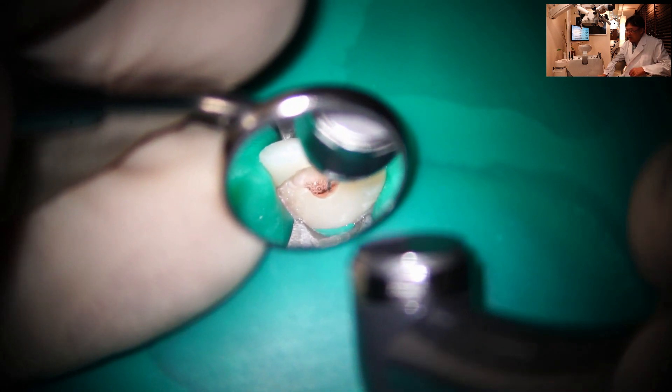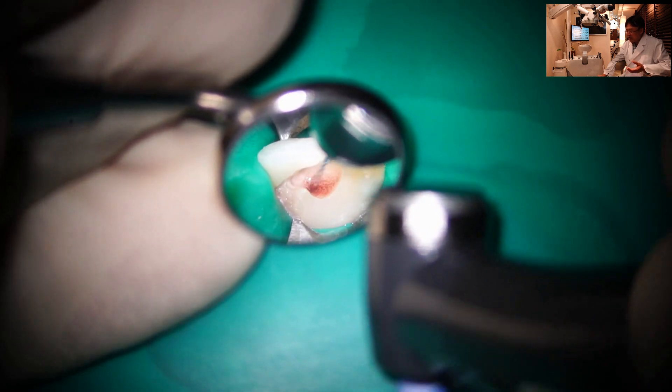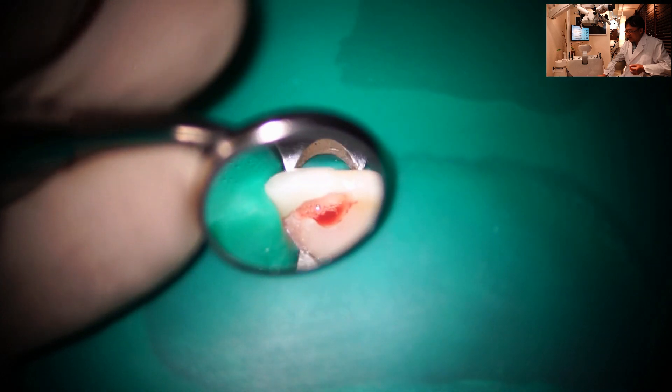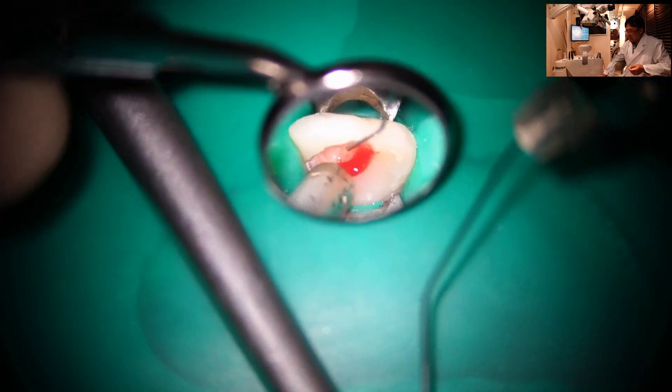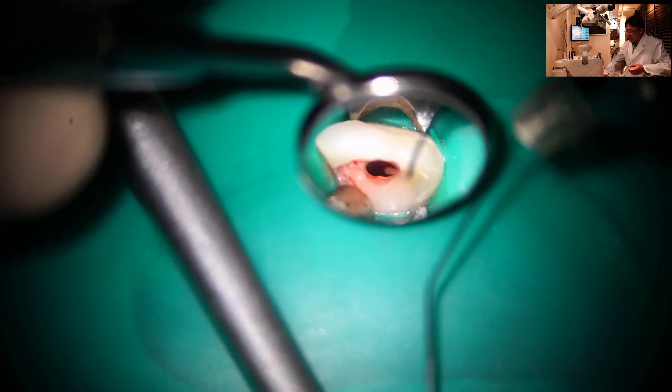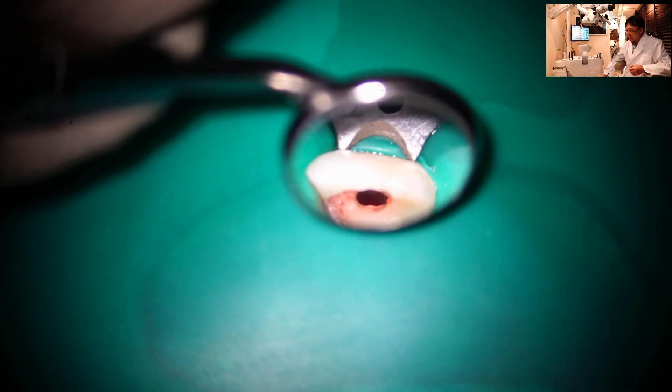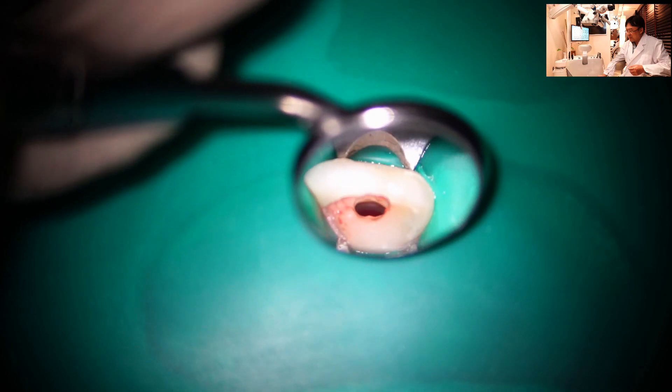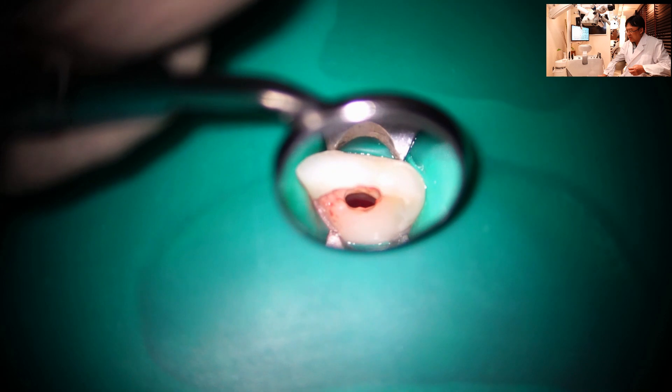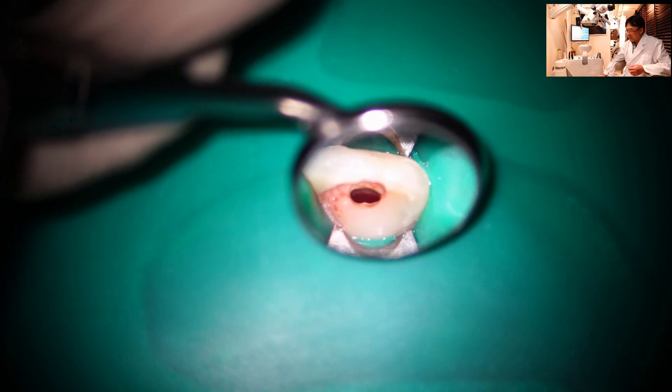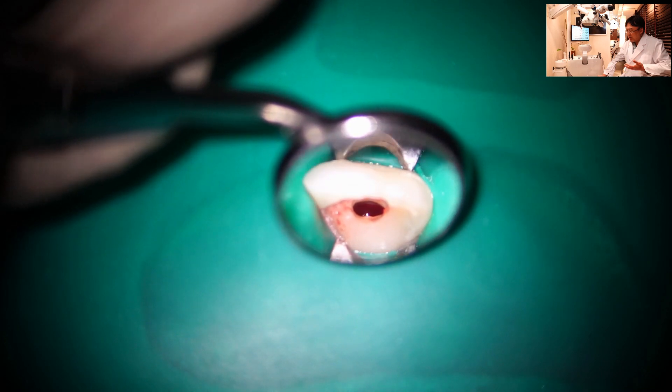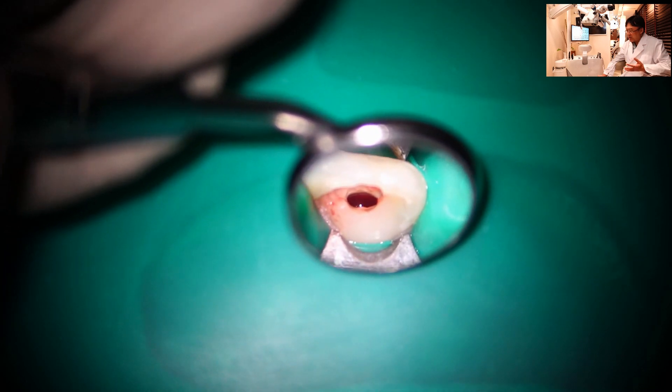So now it's bleeding. I'm drying the canal with a suction irrigator. Then the bleeding is coming up to the CEJ junction.